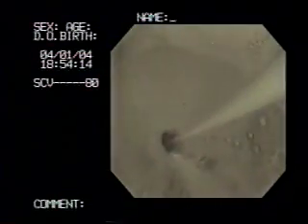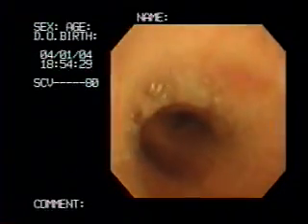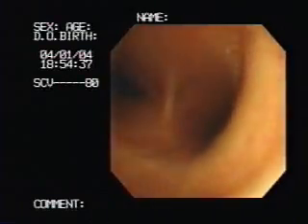The patient is placed under general anesthesia, and the fiber optic scope is passed down the endotracheal tube into the windpipe or trachea. The carina, or junction of the trachea with the mainstem bronchi, is visualized. The mainstem bronchi lead to the right and left lungs.